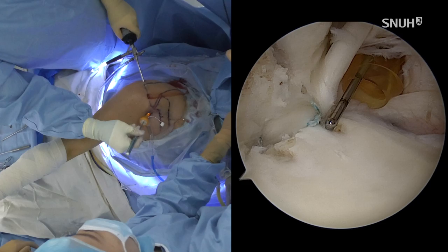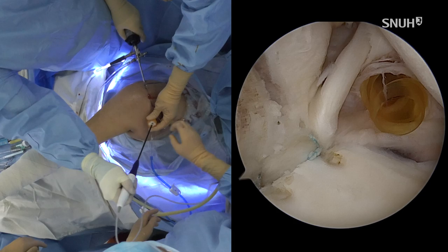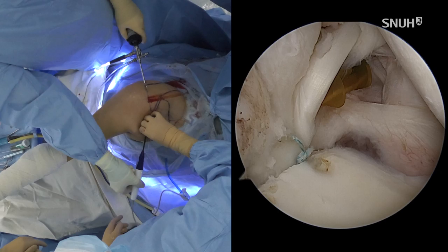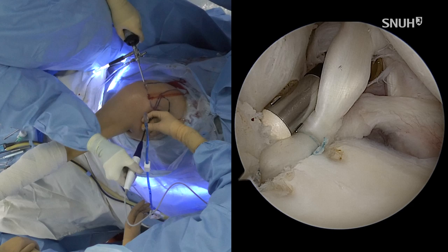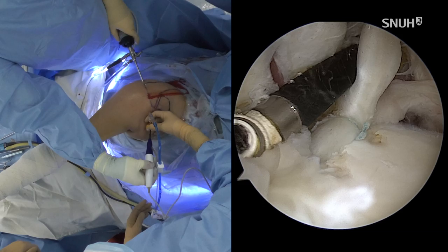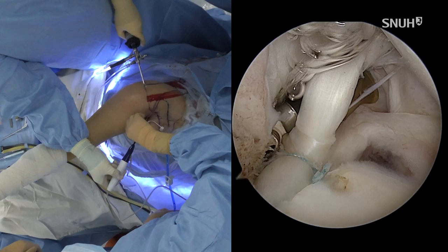But after, you always have to check that the superior capsule is incorporated like that way. So every time I fix the superior labrum, I always release the superior capsule from the superior labrum. You had better release the superior capsule every time to prevent postoperative stiffness. As you know, postoperative stiffness is a major complication of SLAP repair. So release the capsule here.